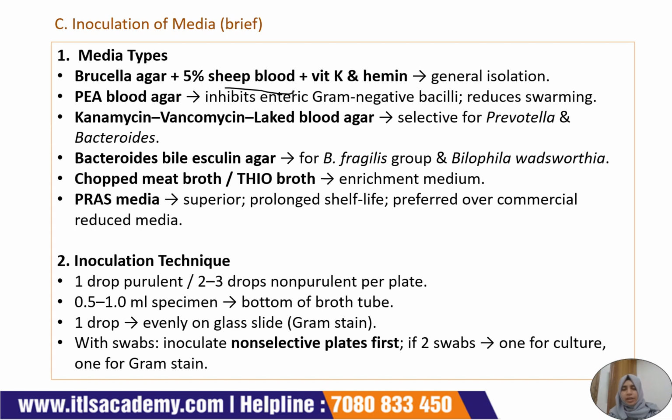For the Bacteroides fragilis group and Bilophila wadsworthia, we use Bacteroides bile esculin agar. We use chopped meat broth or thio broth as an enrichment medium.